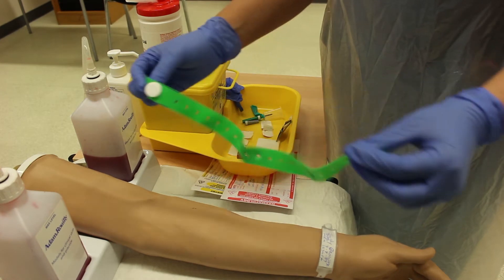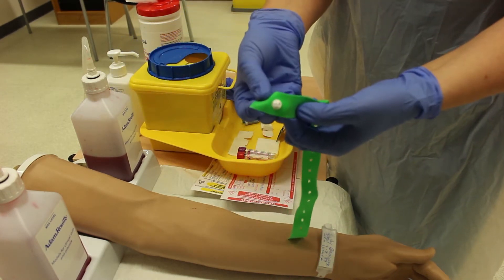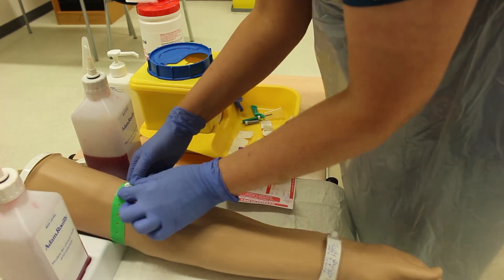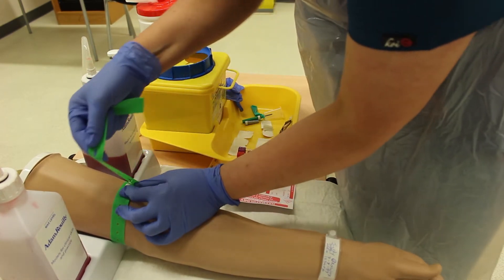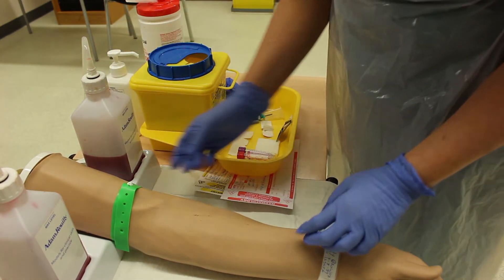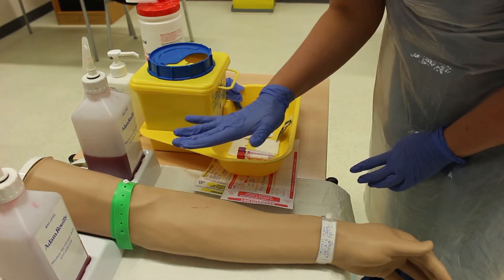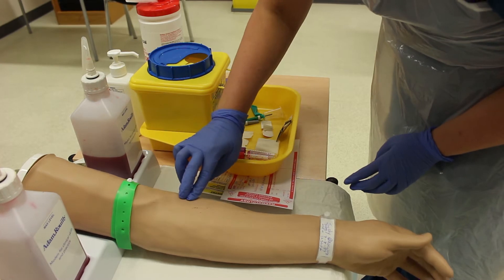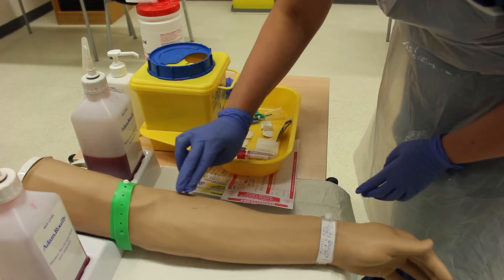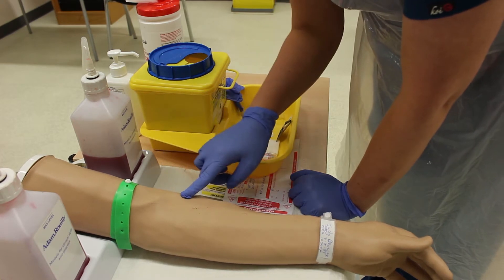Now we're going to put on the tourniquet. This is a single-use disposable tourniquet — the flat part goes to the patient's skin. It should be applied tight but not too tight; check the radial pulse is still present to confirm correct tightness. The tourniquet should not stay on for more than one minute and should be placed five to six centimeters above the chosen site.